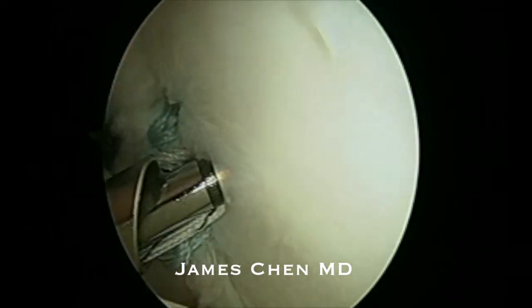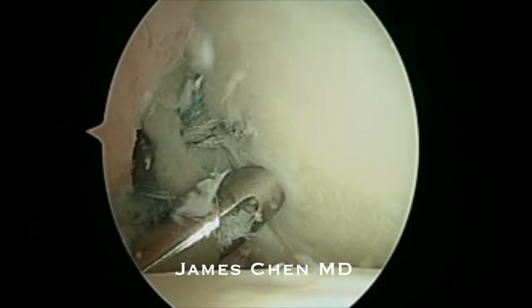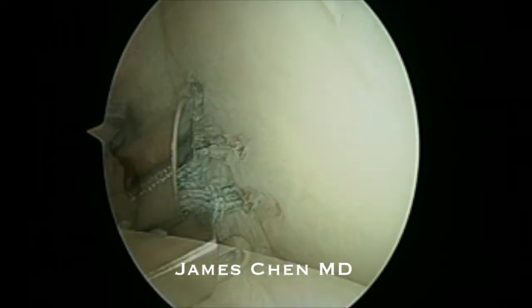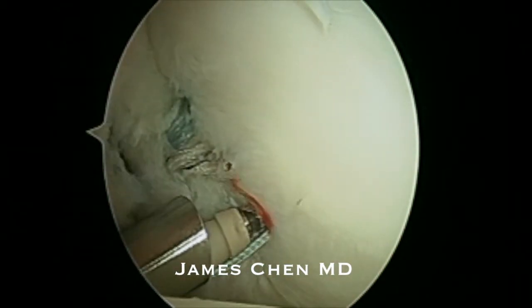I then cut the suture and repeat the procedure a third time. I'm drilling the pilot hole through the accessory portal, retrieving the sutures, loading up onto a 2.9 push lock, and then impacting this into the glenoid.